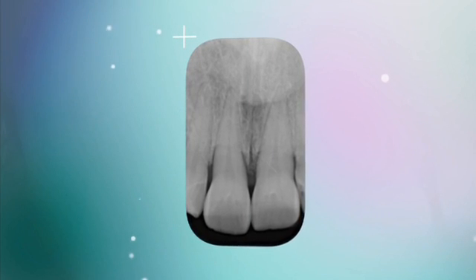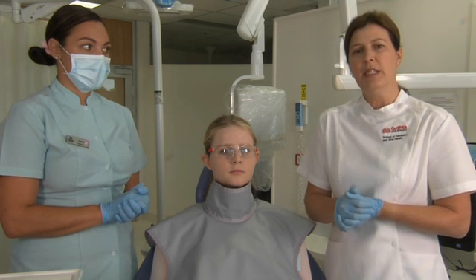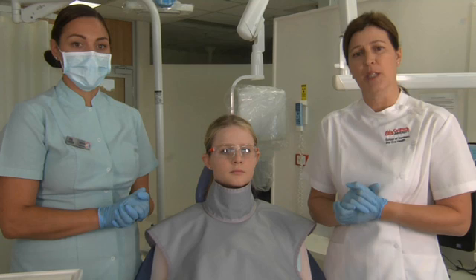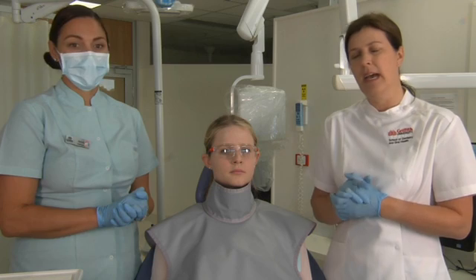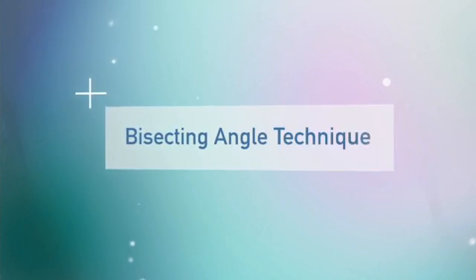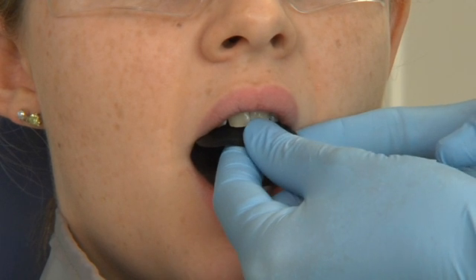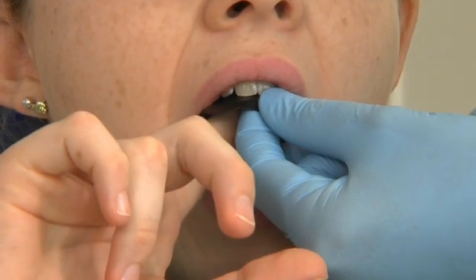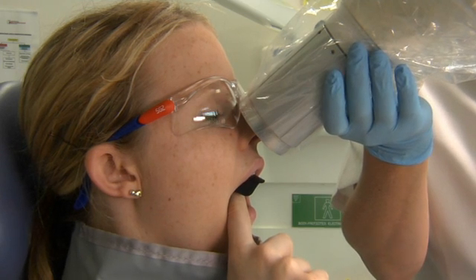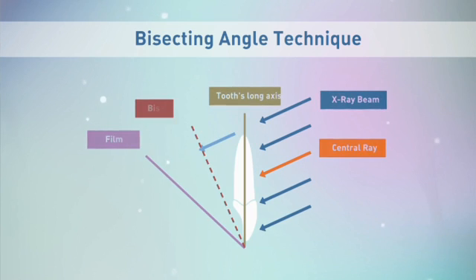Nice and still, Natalie — we're ready to take that x-ray. The paralleling technique is always our first choice when taking a periapical radiograph because there's less radiation scatter and the x-ray is more reproducible at a later stage, hence again reducing the patient's exposure to radiation. In some cases the patient can't tolerate the paralleling holder, so we opt for a second technique known as the bisecting angle technique. I'm going to rest the sensor plate up behind Natalie's upper incisors, and we're going to get Natalie's help with her right index finger to hold the sensor in place on her palate. The cone sits perpendicular to the bisecting plane between the long axis of the teeth and the dental sensor.